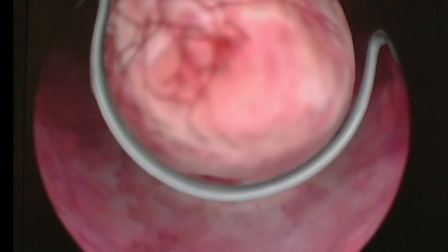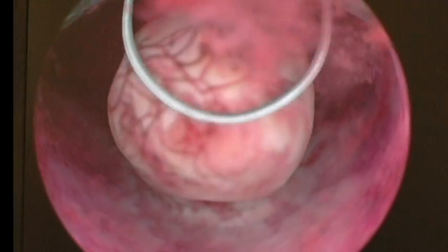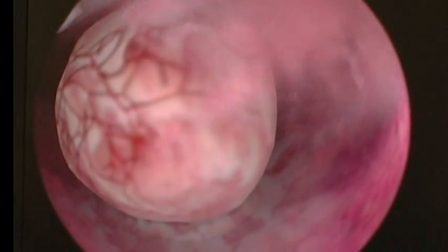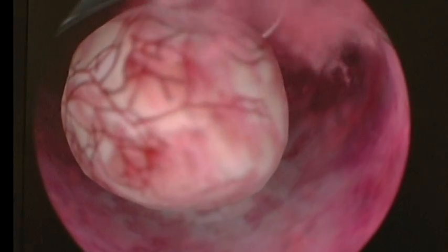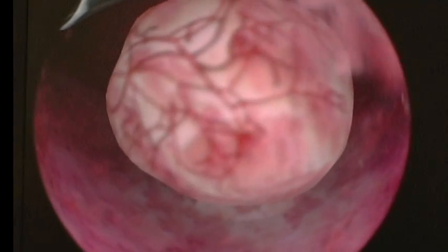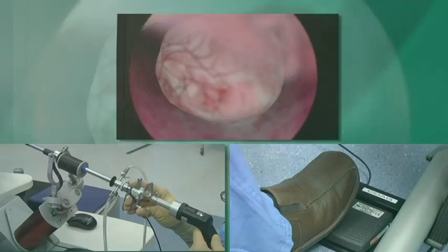Once you visualize the cavity, you can actually take care of your submucous fibroid with your working element and the use of your electrosurgical pedals. Here we can see we're behind the fibroid and we can use our loop.